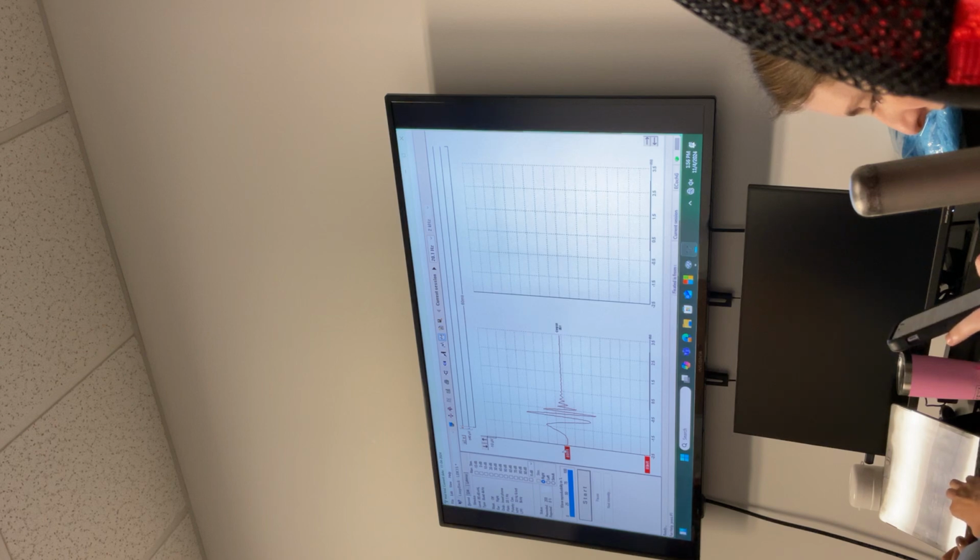For me, once you get familiar with this, I think it's a good thing, positive. Because you don't have to extend the time window, you don't want to have a 20 millisecond recording, 25 and all. What you need is like 12 to 15 is enough. All the stimuli are going to be less than 15.